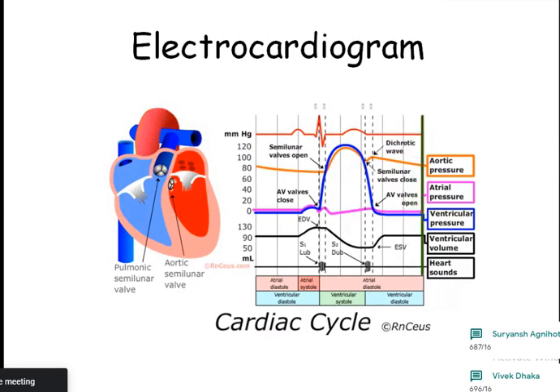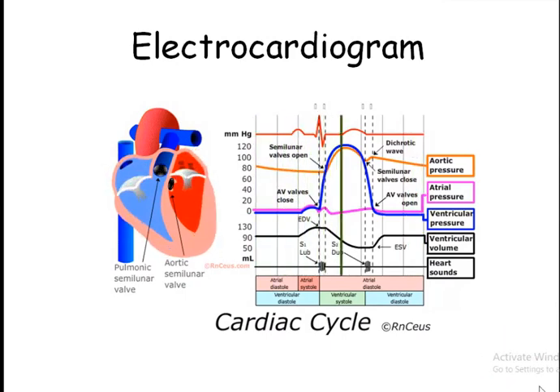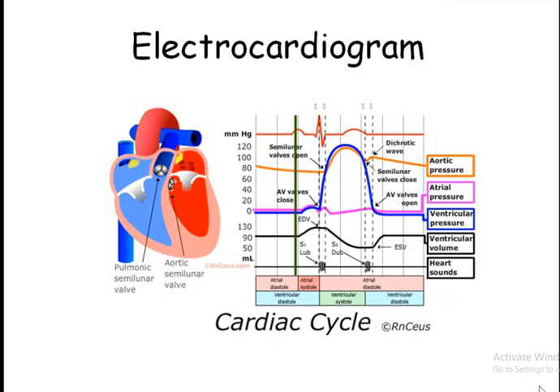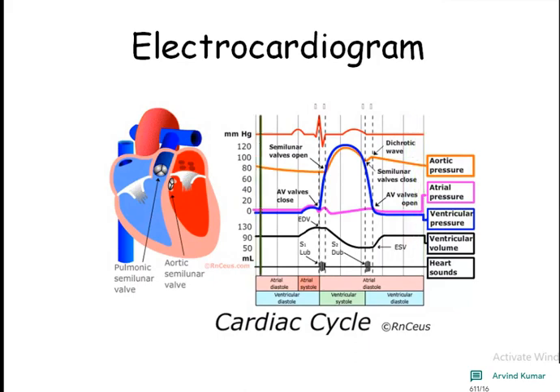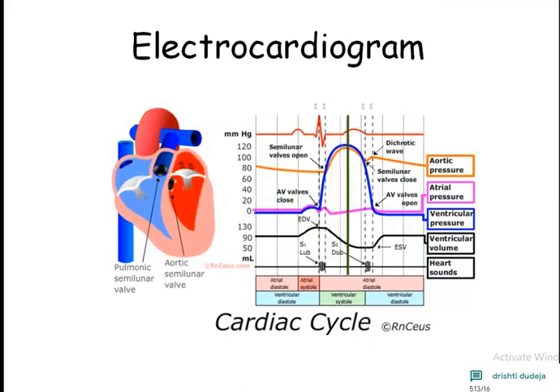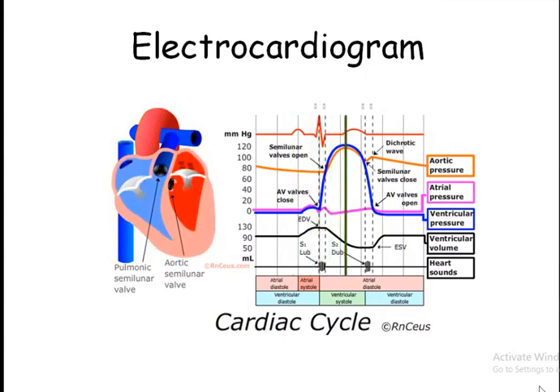Now, among the other methods of non-invasive monitoring of hemodynamics, you can do an ECG. In the ECG, what do you assess? You assess the contractility, mainly the cardiac condition, what is going on in the heart. Through the waves you can say whether there is ischemia, whether there is dysfunction, or blocks, and also myocarditis, and you can assess the condition of the heart.